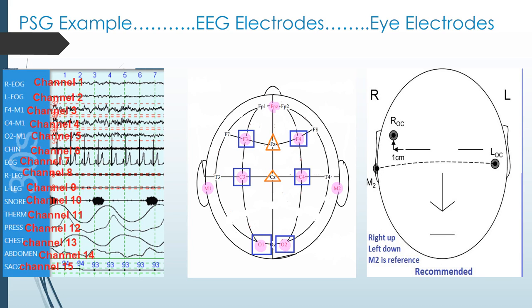And the computer already has that data, because we use the FZ electrode, and inside the computer, nowhere that we set up, that's just automatically doing it, the computer has all the electrodes referenced to the FZ electrode. So in computerized sleep systems, we have to have a system reference, and that is our FZ electrode. Some sleep centers may use a different electrode for that, but it's pretty standard that people use FZ.